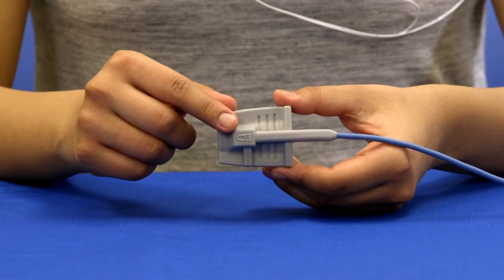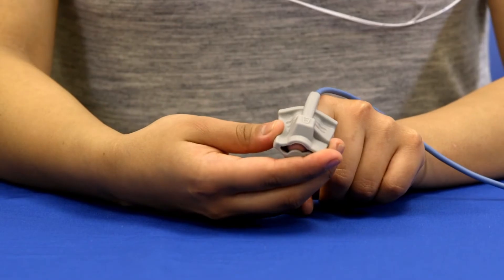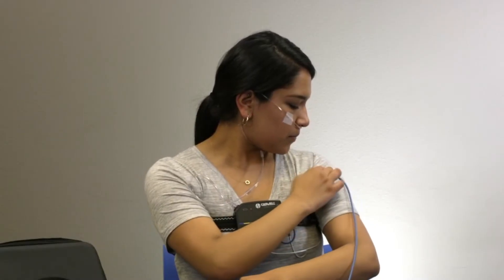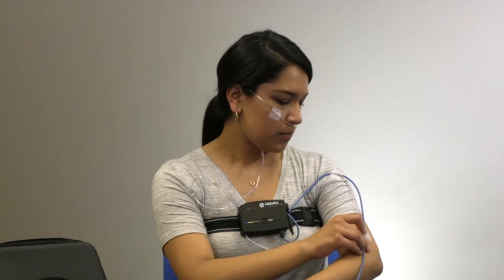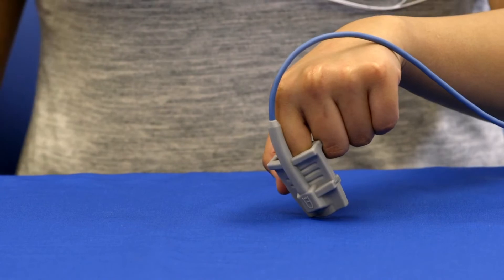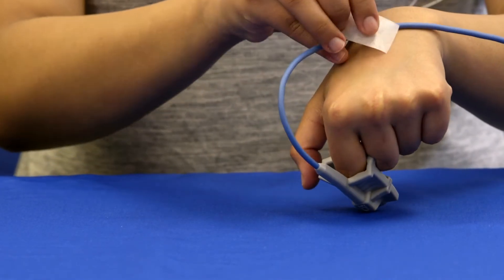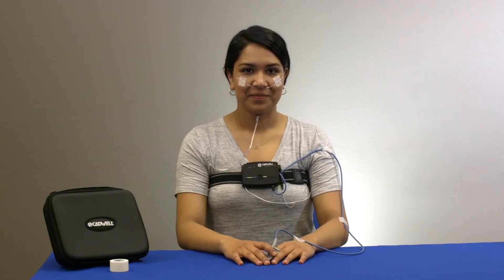Place the oximeter finger sensor on the index finger of either hand with the cable running over the back of your hand. Your finger should go to the end of the sensor but not through the cutout at the end. If the cable hangs loosely, tape the oximeter cable to your shoulder and elbow. If there is no slack, tape it just to your hand. Close your hand into a fist, then tape the cable to the back of your hand. Do not wrap tape around your finger as this will restrict blood flow and reduce signal quality.